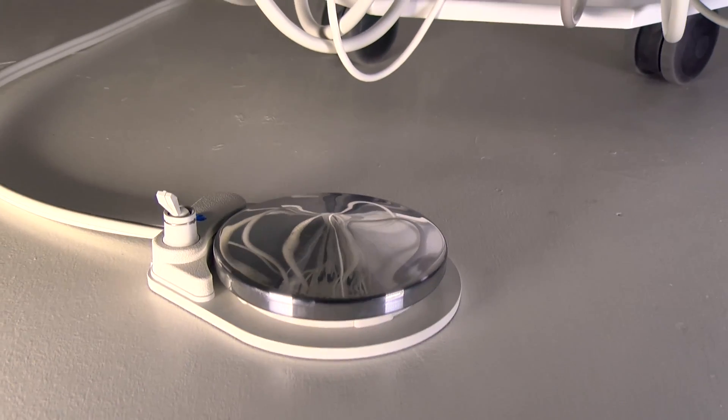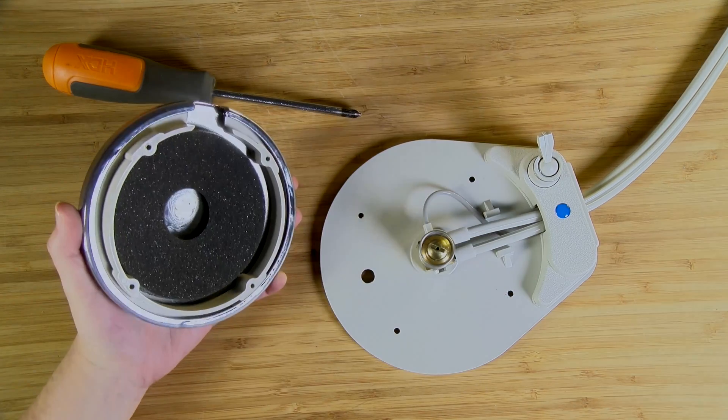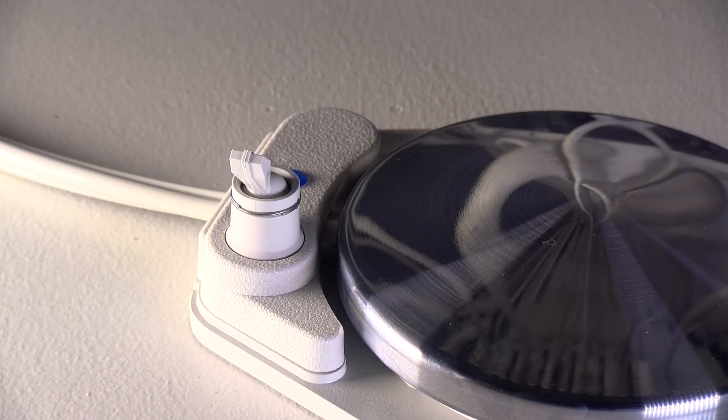The foot control system for operating the handpiece and instruments is a rheostat design for ease of use and features quick exhaust valving with silenced release for quieter use in the treatment setting. The water on/off toggle features a metal tower for dependable heavy use.